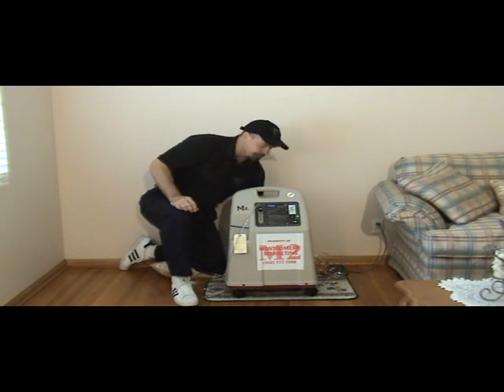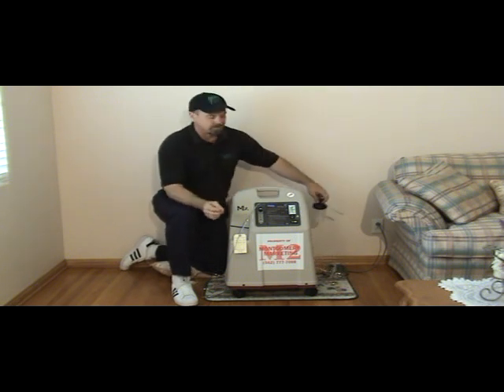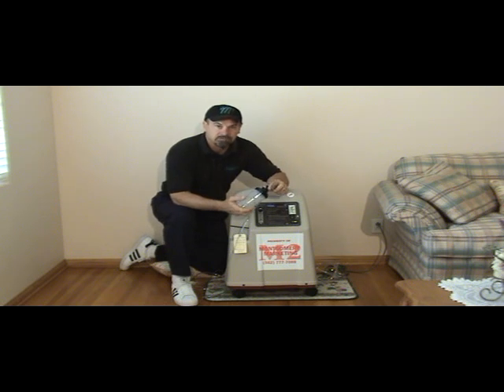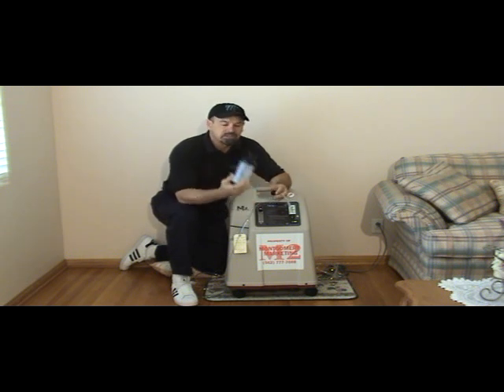Now sometimes you need to provide humidification, especially at high flows. I'm going to ask that you not provide humidification if the patient is not using oxygen continuously, because you should not allow water to sit in a container even like this for a significant amount of time. But if the patient's using higher flows and they have discomfort in the nose, you need to provide a humidifier bottle.